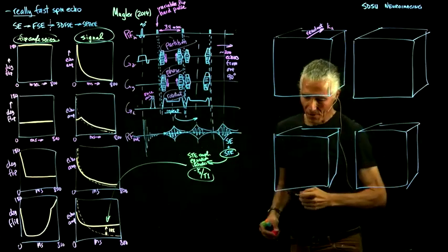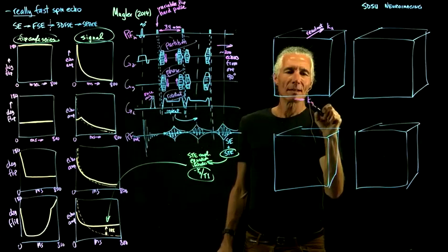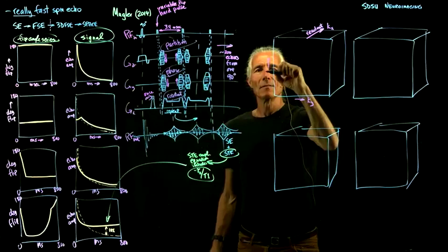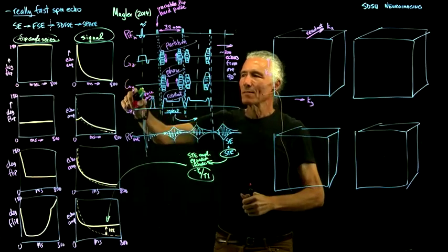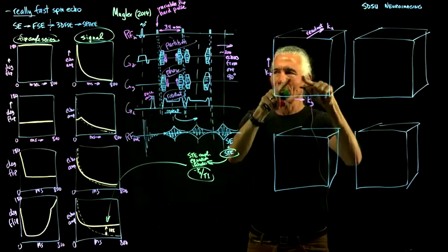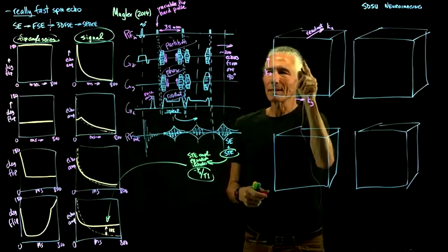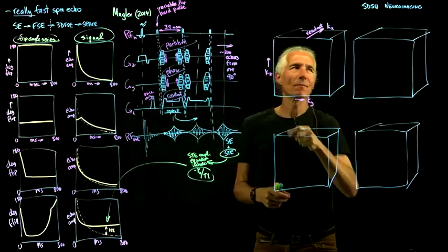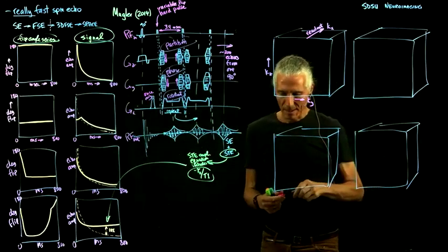And then the other directions are the KY direction and the KZ. So the Z and the Y gradient, all these phase encoding thingies, are what decide where you are in this plane. And then for each point in that plane, you do a readout. So that's the same down here.